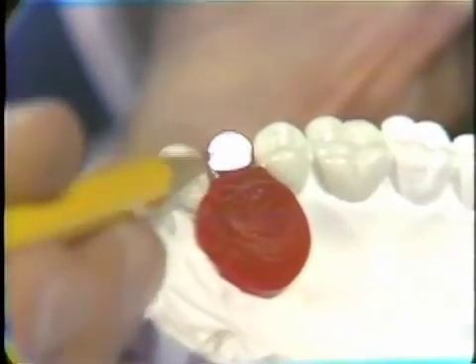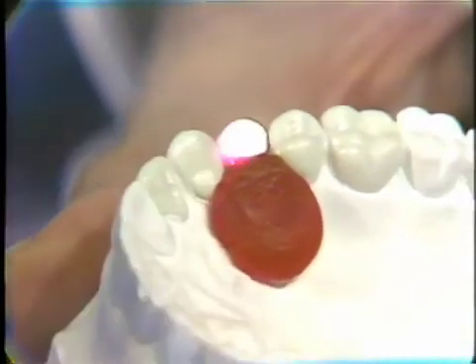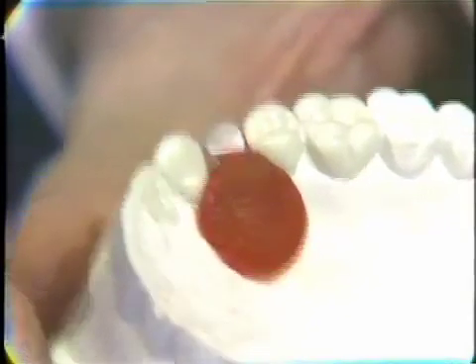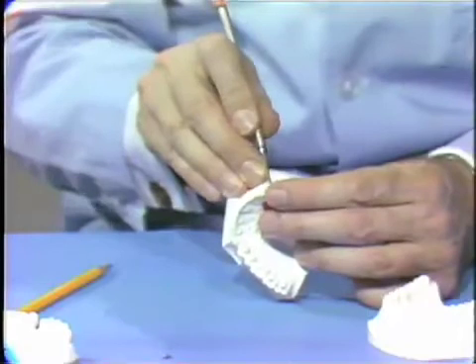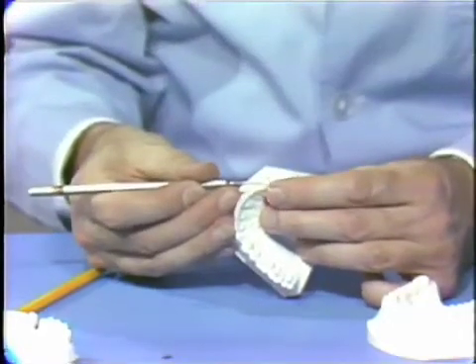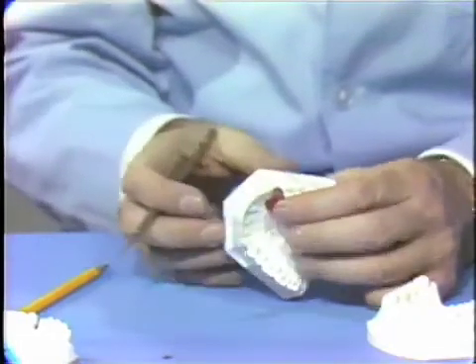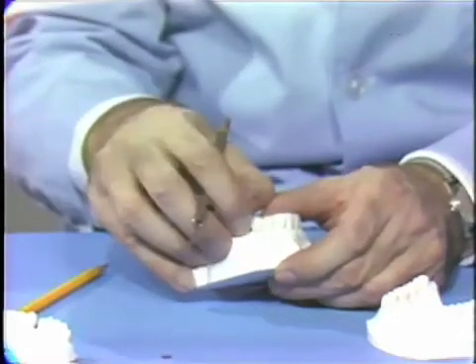We made special provision for that here by those bevels, allowing the gold to extend down proximally in the region of the contact in those situations. Now, the facing should be very precisely placed in exactly the position in which it's required, and it's probably best to do this on the original model rather than the duplicate model on which most of the procedures have been done up to this point.